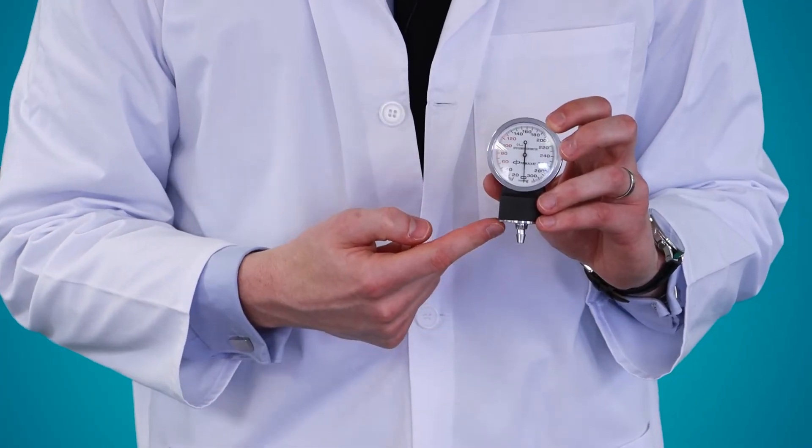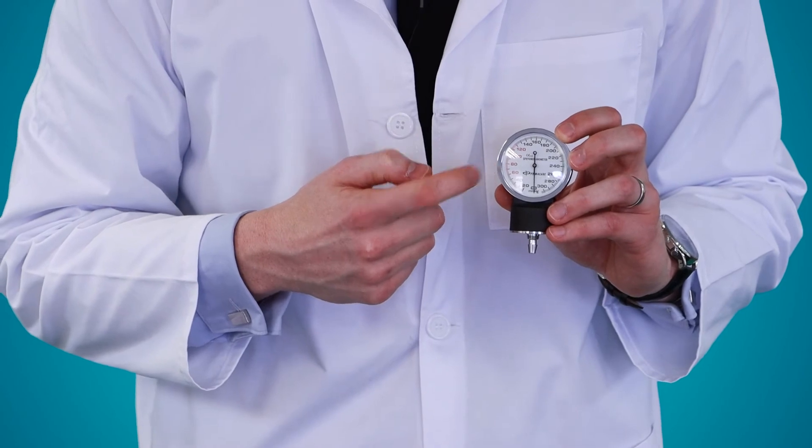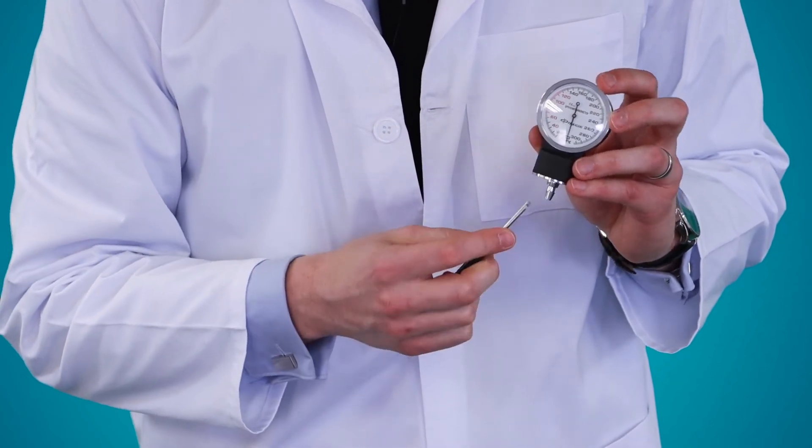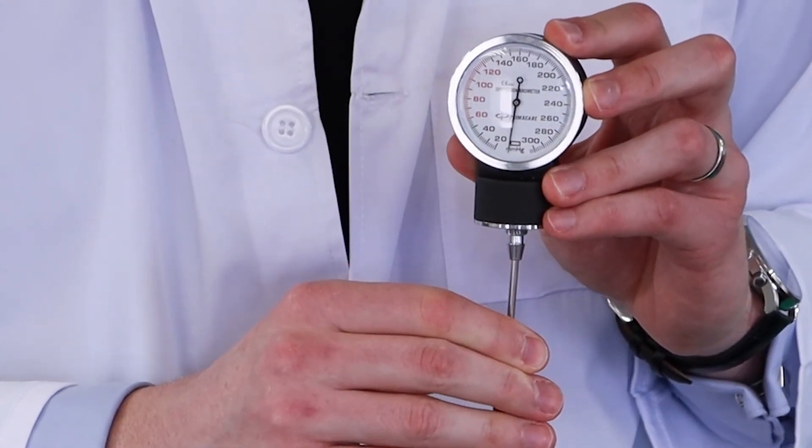This is a 0 to 300 millimeters of mercury, no-pin-stop gauge that improves accuracy. It also has a calibration key that allows you to readjust if it goes off zero.